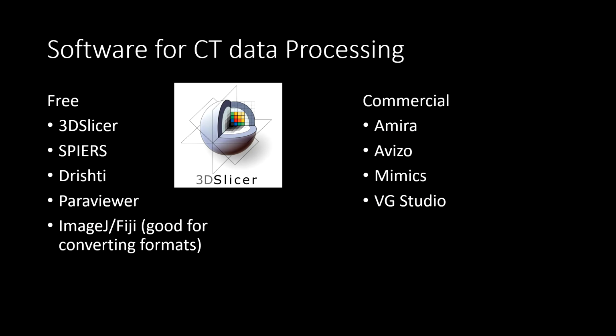Slicer isn't the only tool available for CT data processing, and in fact there are quite a few other free and open source tools you could test out. Slicer was originally designed for medical CT research, so many of its tools are designed specifically for that. However, it has become much more broadly applicable. It can use many different data types, and many different extensions have been developed for it, which gives it lots of different functionality. This is why I prefer it over the other options I have listed.